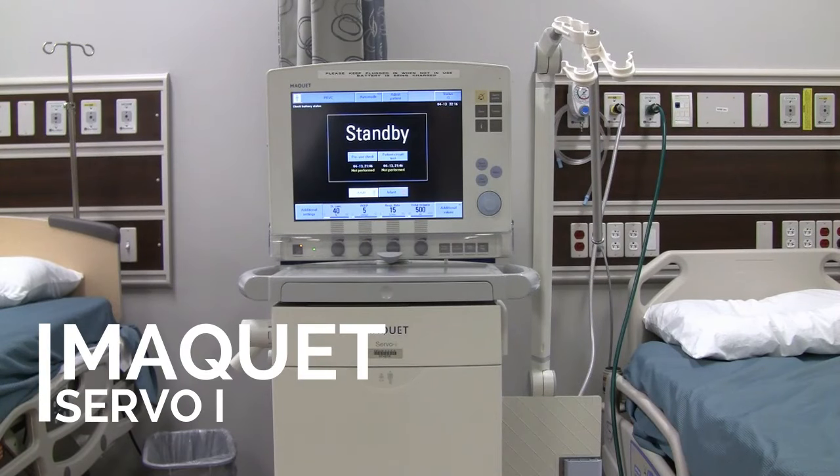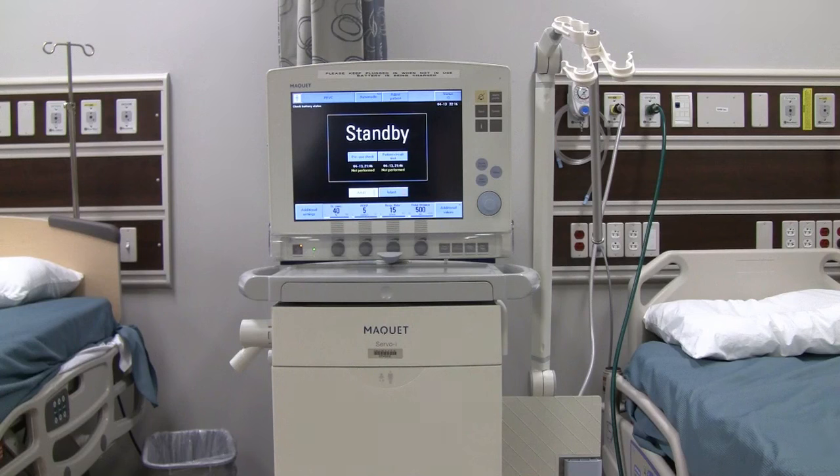Hello and welcome to the Maquet Servo-i ventilator introduction. The first thing you notice when you look at this ventilator is that it has a large monitor right on top. This is your user interface — basically the computer on top where the settings are made and ventilation is monitored.